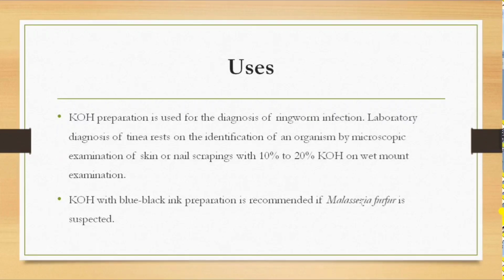KOH preparation is used for the diagnosis of mainly ringworm infection; for all dermatophytic infections, KOH preparation can be used. Laboratory diagnosis of tinea is based on the identification of the organism by microscopic examination of skin or nail scrapings with 10 to 20% KOH on wet mount examination.